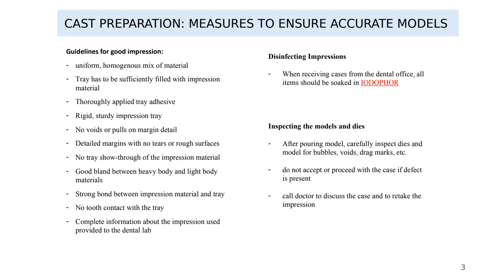Also, what we're looking for in an impression: no voids or pulls, and clear margin detail. So anytime we receive an impression from the doctor's office, we disinfect, of course, the impressions and everything that comes from the doctor's office, but we have to inspect the impression, especially the margins. So if we see that there are little voids inside the margins, that means the impression is not accurate. So we can call the doctor and say, I'm sorry, doc, but you need to call the patient back and retake the impression, okay?